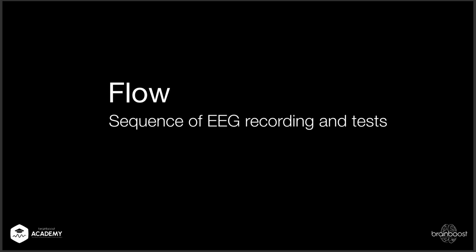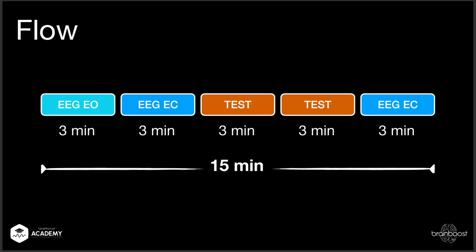So it's not only in the Brain Assistant now, because we want you as therapists to basically do any session you want and do any intervention you want and just say, what software do I use? I use Brain Assistant, of course. So whatever we also use in our software, in our practice here, we want to have in our own software, of course. So all the data is kept together, and you don't have 3 Excel files and a Word document, etc. So one flow could also be short, 15 minutes.